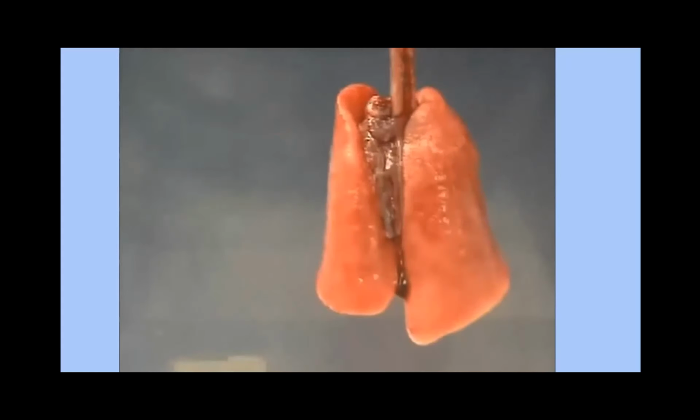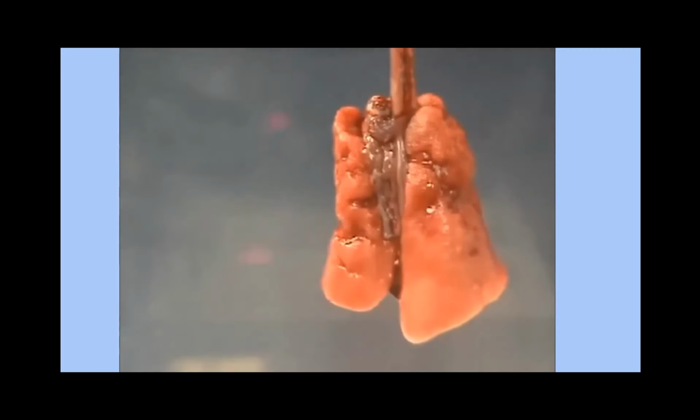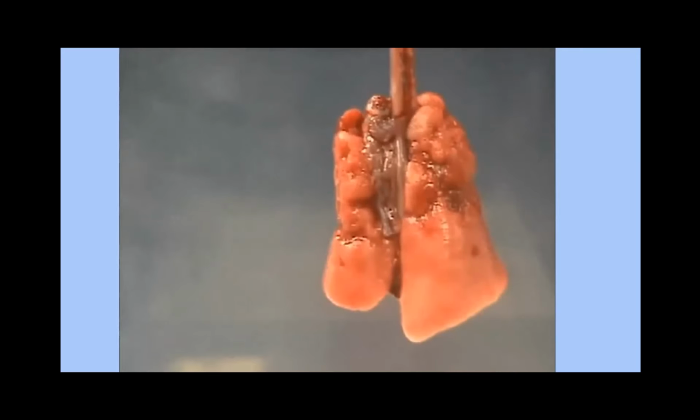What you're going to see is that now the lungs that you have in the end are recruited lungs because all of those alveoli are now open. Take into account that PEEP and tidal volume have nothing to do with each other. Just because you go up on your PEEP doesn't mean you're giving more volume to the patient. What you're achieving by giving more PEEP to the ventilator is just opening up more areas of the lung.